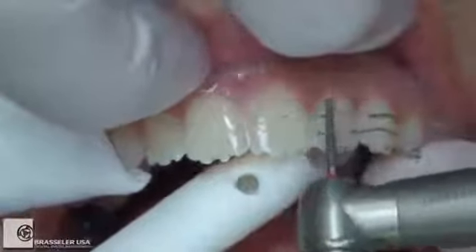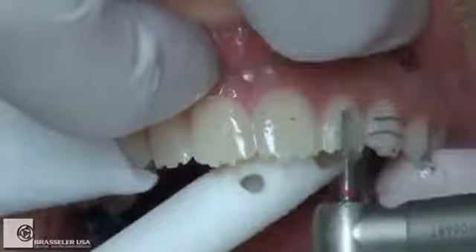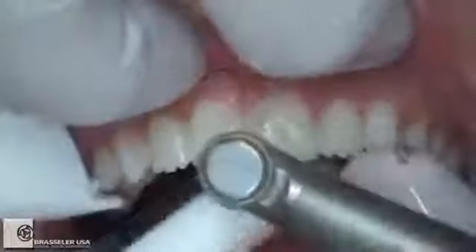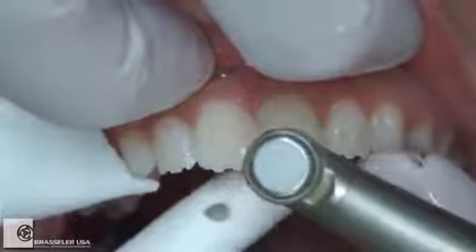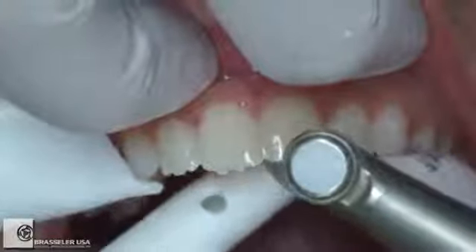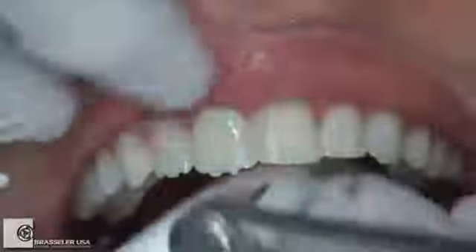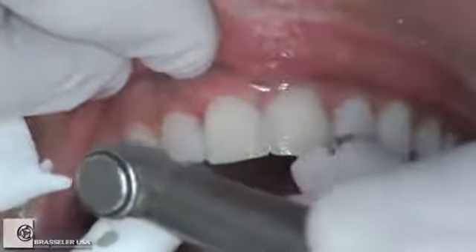Make sure that you adequately reduce in the line angles. And since we're preparing all 6 teeth, we can go into the interproximal area just a little bit here. If I was only doing one tooth and stopping, let's say at the lateral incisor, I'd be very careful that I didn't adjust to the natural tooth that I wasn't going to restore.